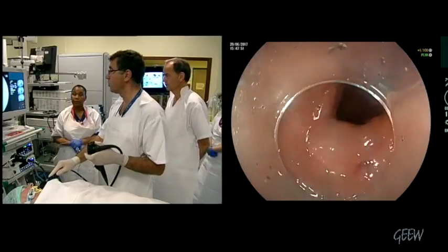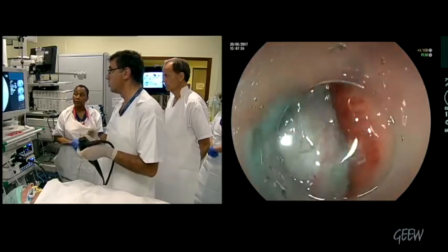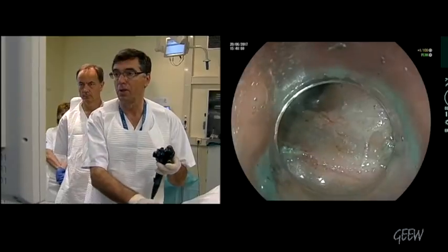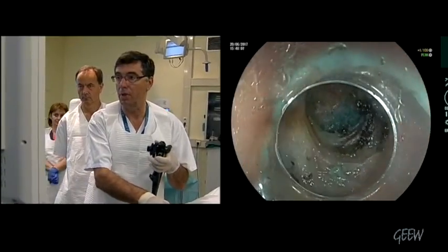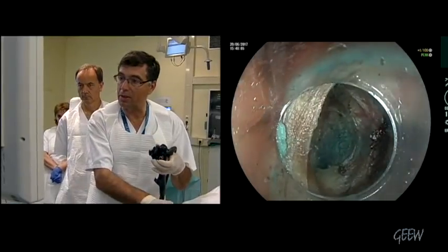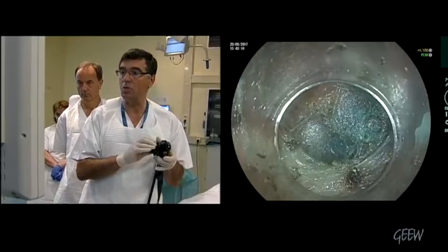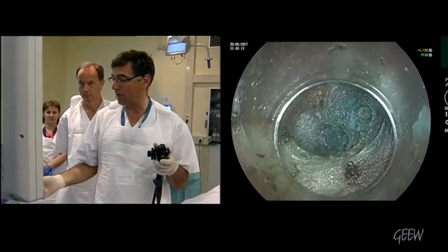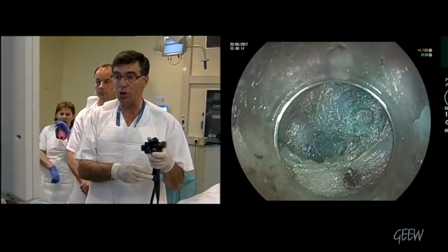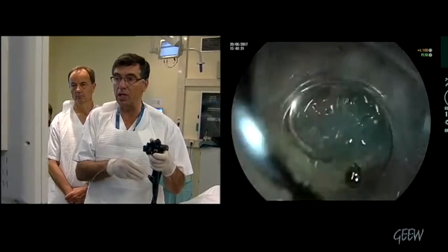You can see the blue tunnel. We are going back to the mucosal entrance. At the deeper part, this is the pyloric arch — you can see the white arch. The blue part just behind the pyloric arch is submucosa into the bulb.